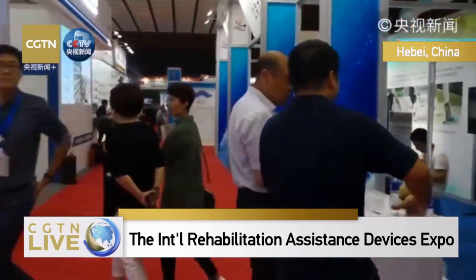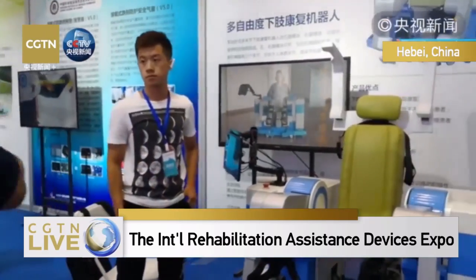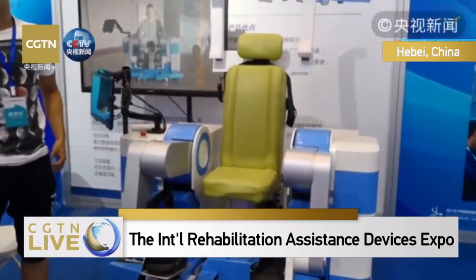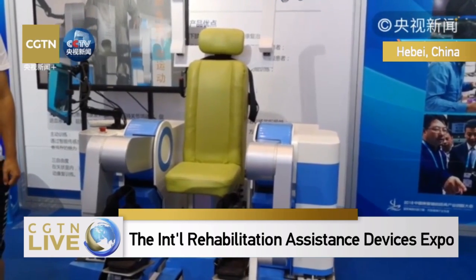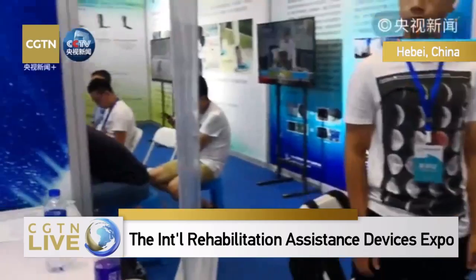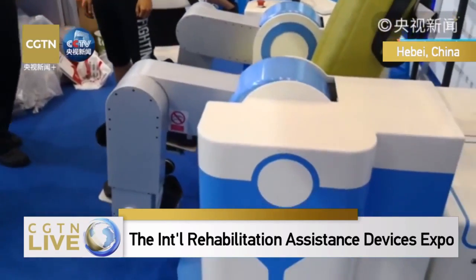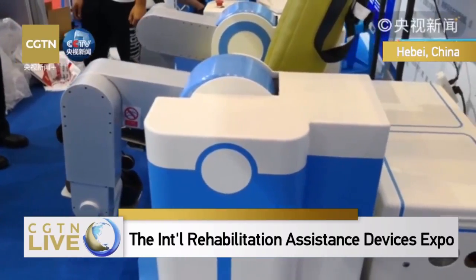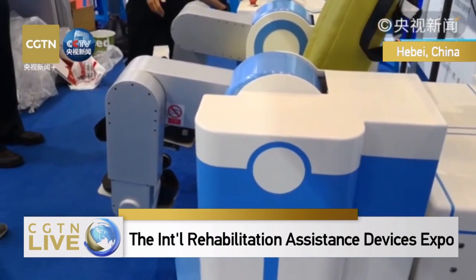We see a lot of universities bringing their lab research results. And they have also made a lot of innovation on top of the existing products in order to lower the risk. These research institutes and universities are highly innovative, and they are looking forward to working with the enterprises to transform the lab results into marketized products. Can you show us how this works?